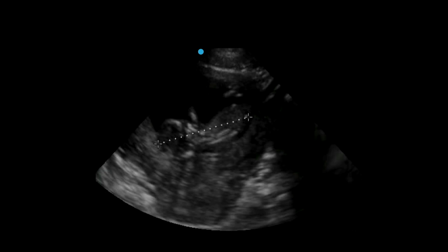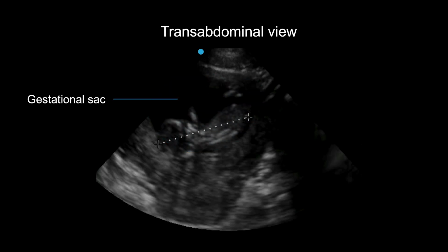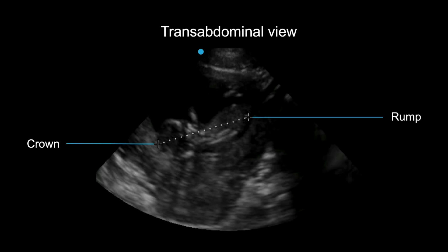Here we're seeing an image of a transabdominal pelvis study identifying a fetus within a gestational sac. Once you identify the fetus, fan through the image until you see the fetus in the longest cross-section. Freeze your image here. Next, take out your calipers and measure from the crown, or the top of the head, to the rump, which is essentially the bottom.